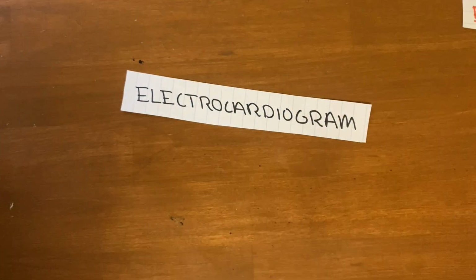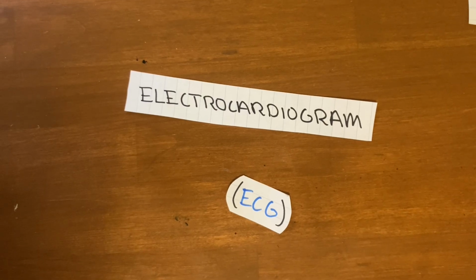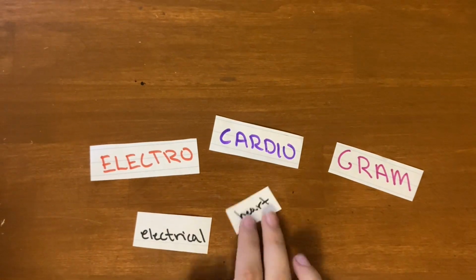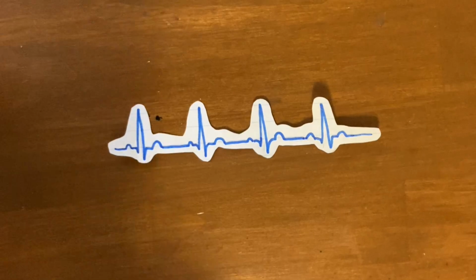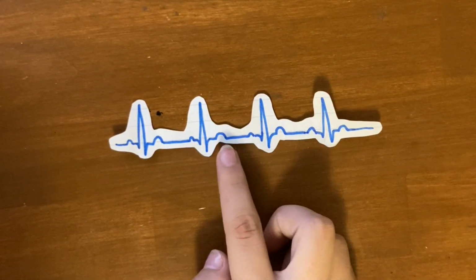In this video, we will be discussing the electrocardiogram, or ECG for short. The word electrocardiogram can be separated into three parts: electro, cardio, and gram, practically meaning an electrical heart drawing. The ECG provides us with a visual representation of depolarization wave movements during each heartbeat.